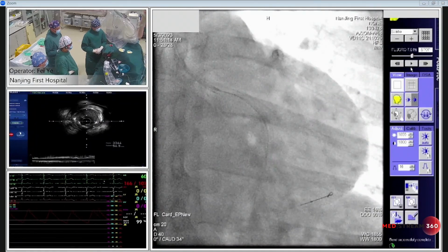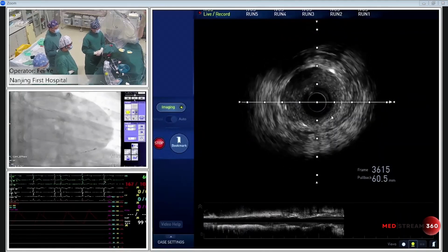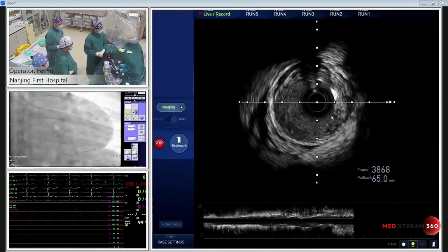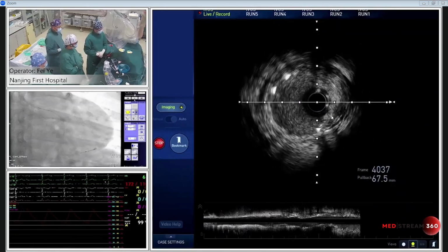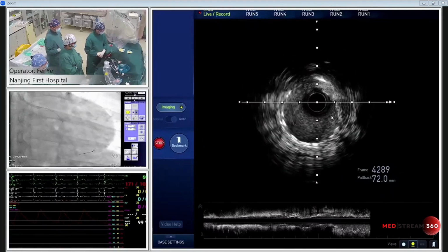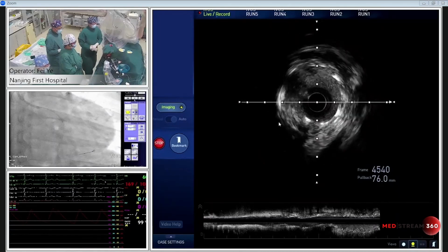It's a proximal circumflex. Stent mean diameter more than 3.0. Just below the first bifurcation lesion, I think. You cannot see the OM1. It's not coming. Not found it. One moment, maybe it's coming now. Yes, I think so. This is OM. Yes, we can see. I think the result is quite good.